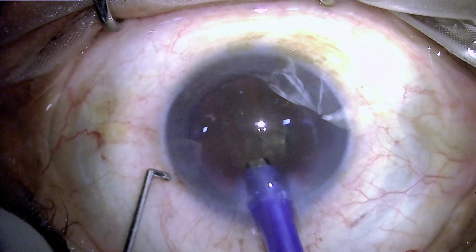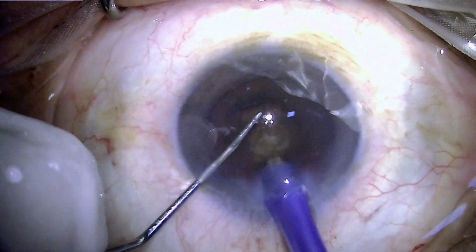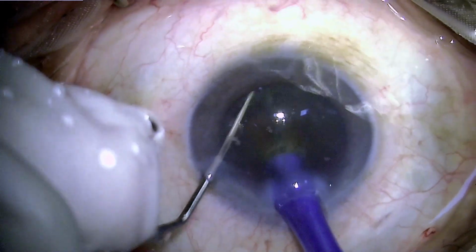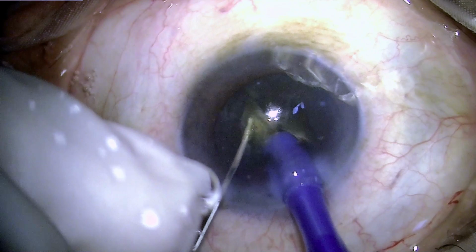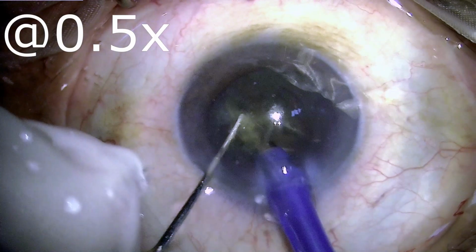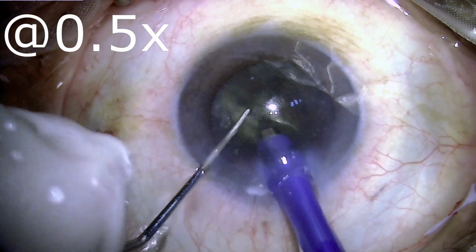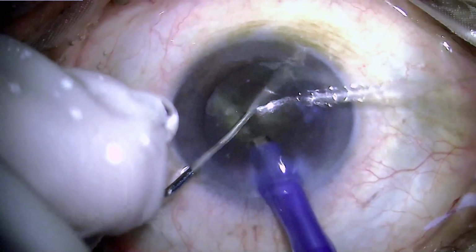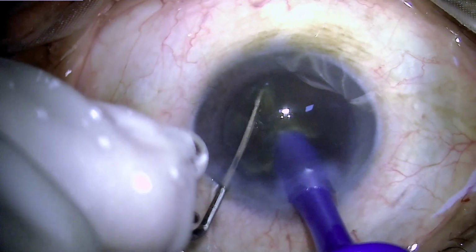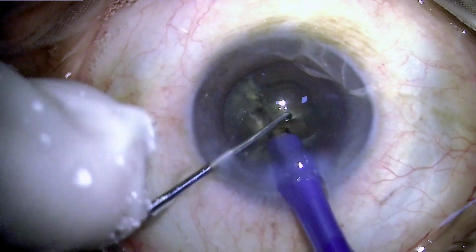Now the moment we go for horizontal chop, we'll see that once the phaco tip has been buried and the chop has been conducted, when the phaco tip releases the nucleus segment, the pupil gets small, the chamber collapses, and then immediately it regains. Now this is what is described as surge, outflow which outmatches and is much higher than the inflow because of the negative pressure in the aspiration line.